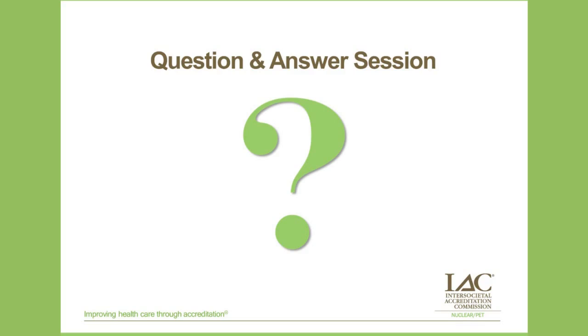Great. Okay, next question. Would you see heart uptake in bone scans if amyloidosis is suspected? I think if they're asking if you'll see the myocardial uptake, if it is suggestive of cardiac amyloid, then you will see it in the myocardium, but you will always see it in the bones because it is a bone agent that you're using.